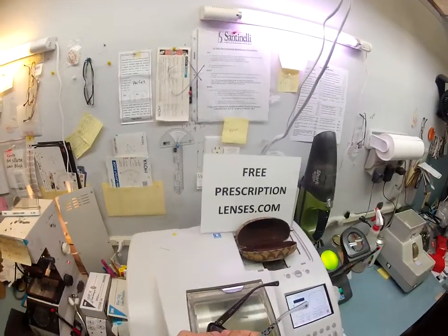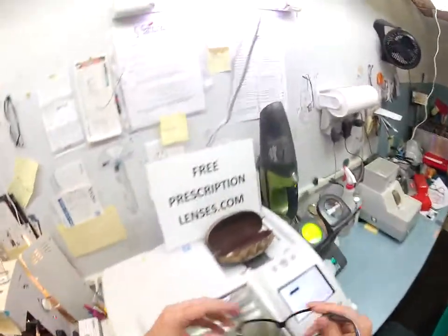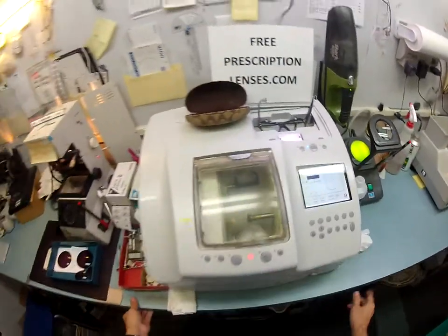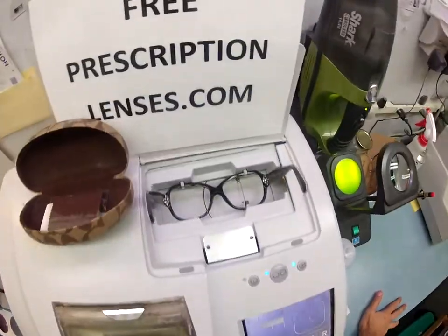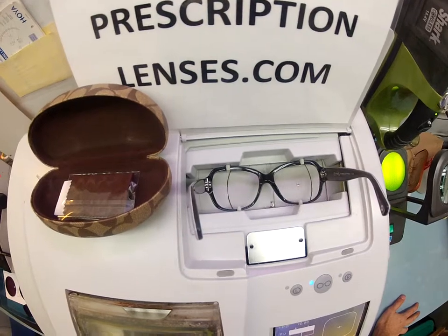So the first thing I'm going to do is pop your original demo lenses out of your frame and move your Coach case and put your Coach sunglass frame into my Santinelli LE1000 patternless edger. The stylus is now tracing the shape of your right lens, and then it's going to scoot over and trace the shape of your left lens.